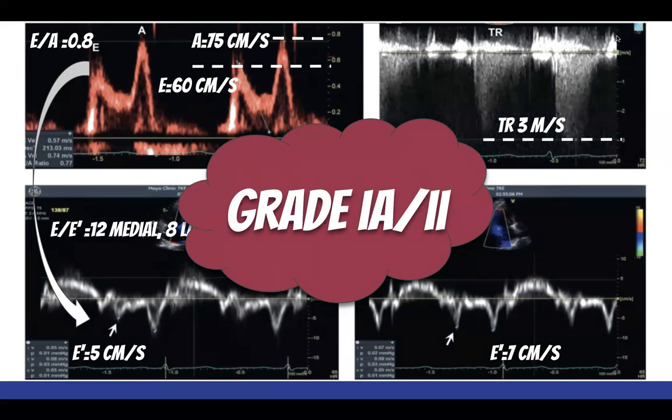So the only giveaway is the TR velocity is more than 2.8. Yeah, so the filling pressures are higher. So maybe this is a question for Avi if he's still here. I don't know, for the boards, I guess we should go with the guidelines, but I'm not sure. Avi? Go with the guideline. Go with the guideline.